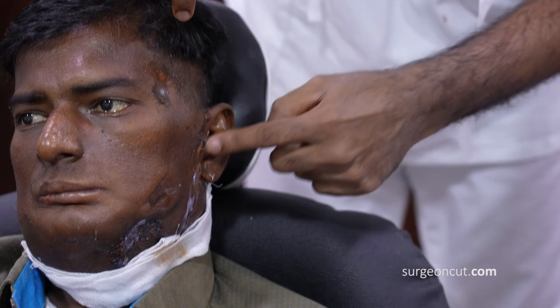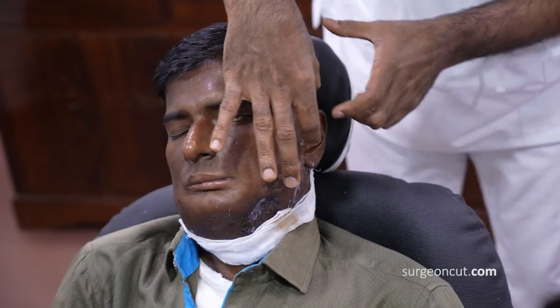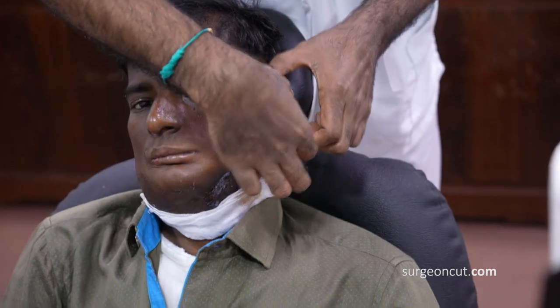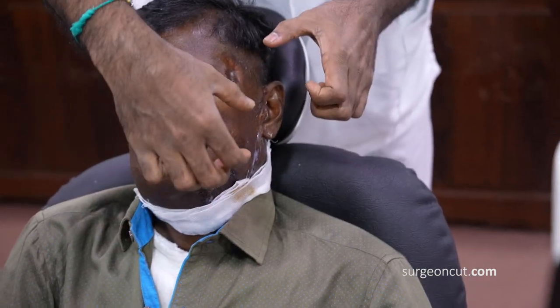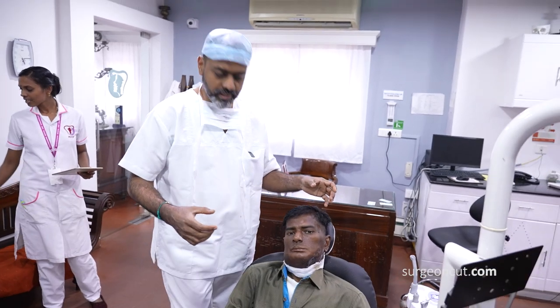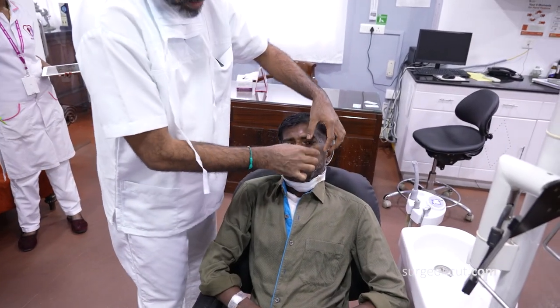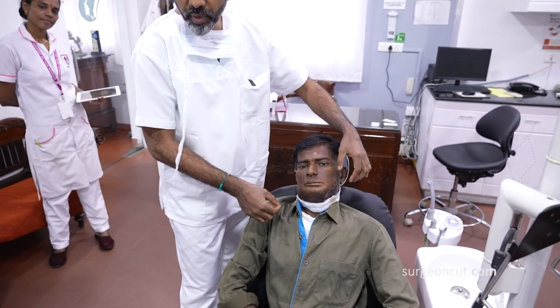And you can see the incision for that. So we use this incision on the scalp for the joint replacement. And on that joint replacement prosthesis, which is a PSI or a patient-specific implant, which we had done with a CAD-CAM model, the flap from the leg, the bone and the soft tissue, is placed from inside with a microvascular anastomosis by a 3-member surgical team.